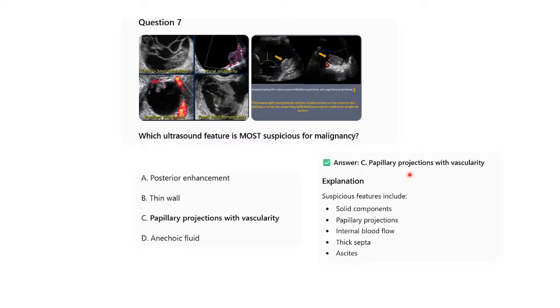So let me give you another video with vascularity. Papillary projections are these ones, the masses that you see developing inside. You can see here on color Doppler, to make sure that they are growing nicely. You can see how it is living pink color tissue. Look at that. Doppler, and then you see that there's blood flow inside.